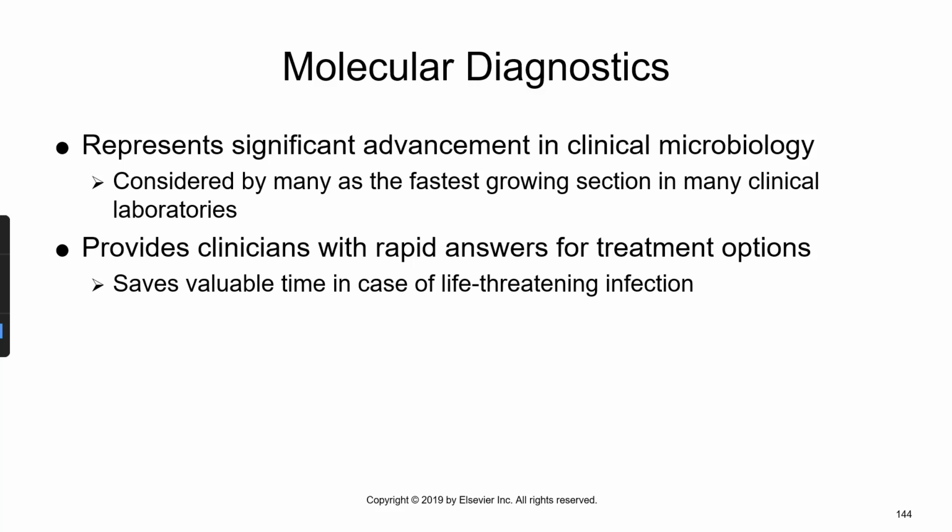So we know the gram stain result, and the doctor can start treatment a little bit, but we don't really know the causative agent, which microorganism is causing the infection, for about 1 to 3 days. With the advancement in molecular diagnostics, we can take a small drop of that infected blood, put it into a molecular diagnostic tool, and they have different types of systems that can identify the genetic material of different types of organisms, and we can get an identification within several hours. So instead of waiting a day to 3 days, we can get that diagnostic information finalized and sent up to the doctor sooner.